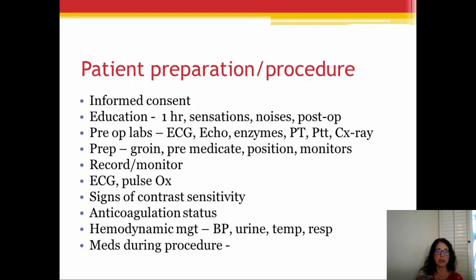Recording and monitoring, we said that. EKG continuous during the procedure, and pulse ox. Signs of contrast sensitivity. People can have a reaction to the dye that you're shooting, so you want to find out, do they just break out a rash? Did they have something before? You want to monitor for that.